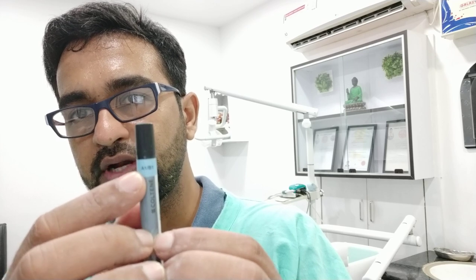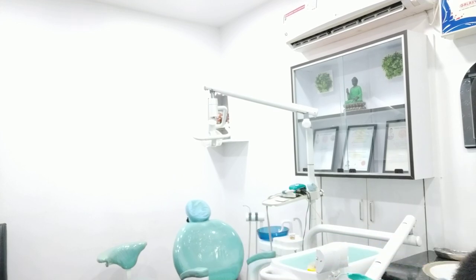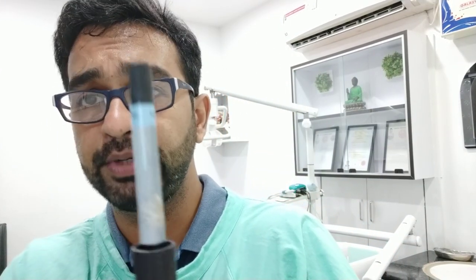I have not tried Shofu on posterior restorations. I got it in two colors: A1 and A2, which I basically use. The best thing about Synergy D6 by Coltene is that it comes in dual shade — this one is A1 B1 as you can see written here, and there is another one that comes in A2 B2 as well.